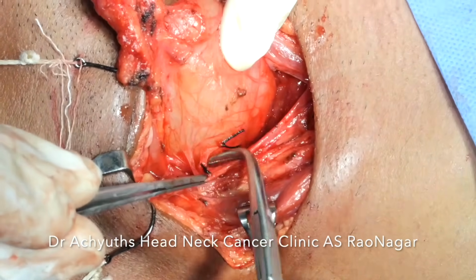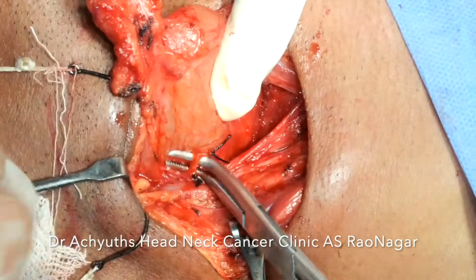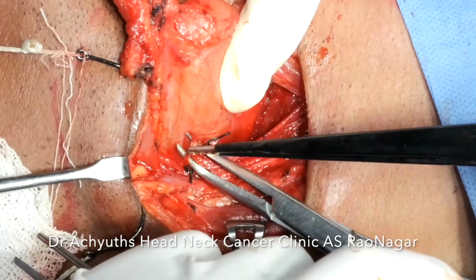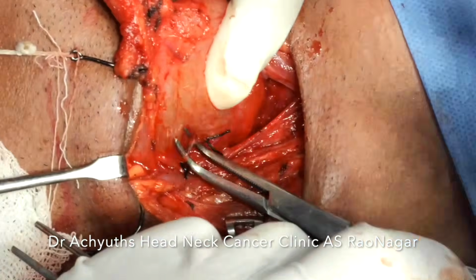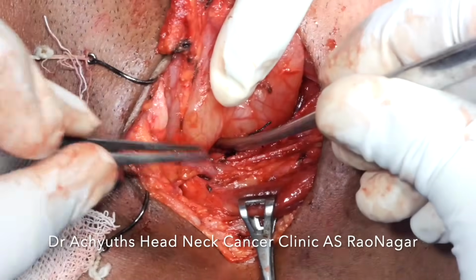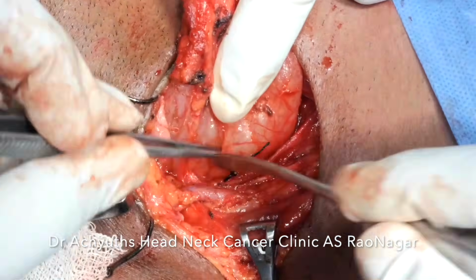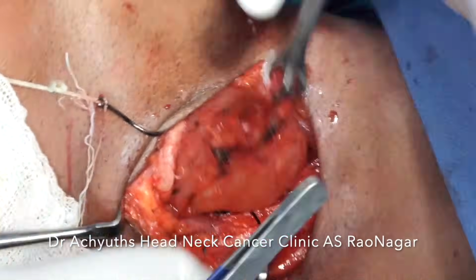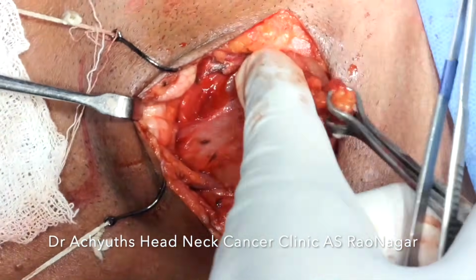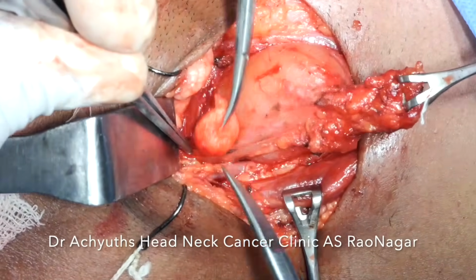So in those cases where they are using on-needle suture material, this is how I tie. I don't usually do the normal freehand knots, because we'll be wasting much of the suture material. So with the help of forceps only I usually do the surgical knots.